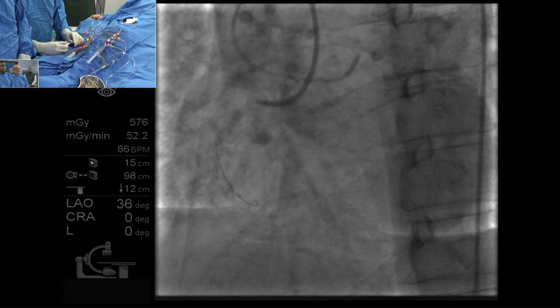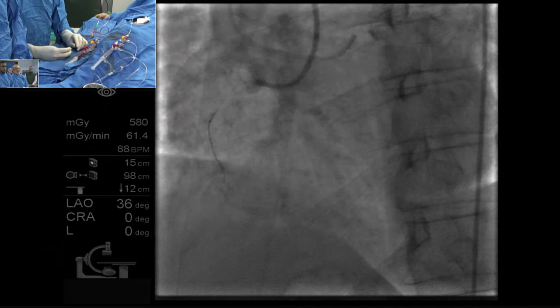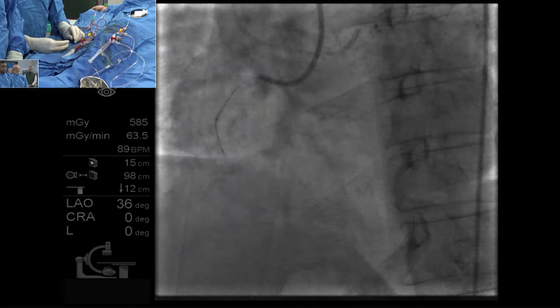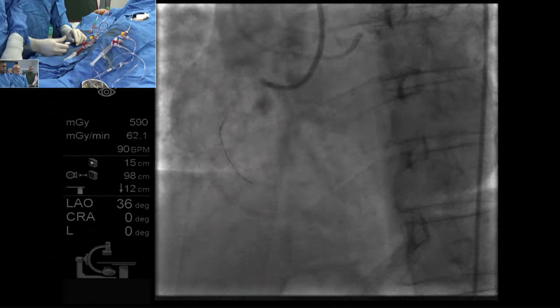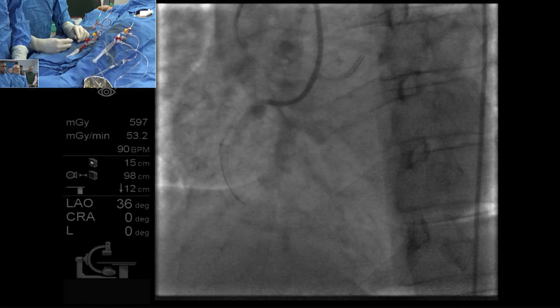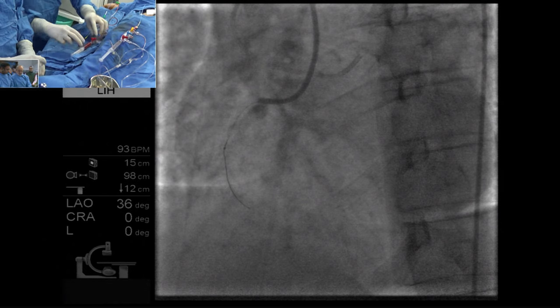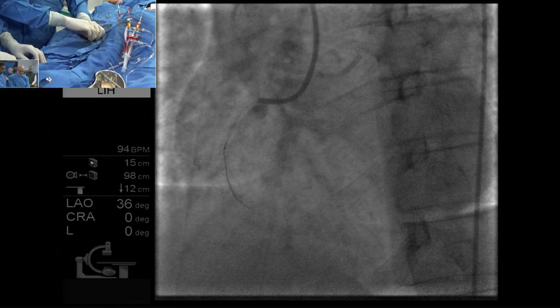I think a Pilot 150 should be useful. How about dilating that spot with a 1.2 balloon to put the Fine Cross further down? That's what Rajni suggested and I am toying with that idea. I think we have to bring this Fine Cross down. 1.2 Emerge push.